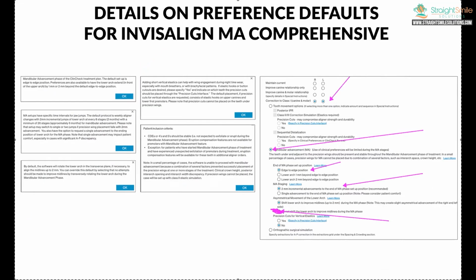Hey, this is Dr. Amanda with StraightSmile Solutions, StraightSmileSolutions.com, and hopefully you watched my first video on the Invisalign MA feature. I would say you definitely need to watch that video before you listen to this video, or this is going to make zero sense, because I'm not going to repeat everything and bore you guys. But basically, I dig into the defaults and how to submit a case through Comprehensive for MA, what type of cases would be good, how it works. And now I'm going to dig in a little bit more to each of these individual defaults and what they mean, based on what I think. So listen to the disclaimer in the first video.